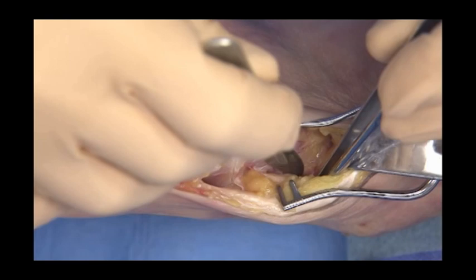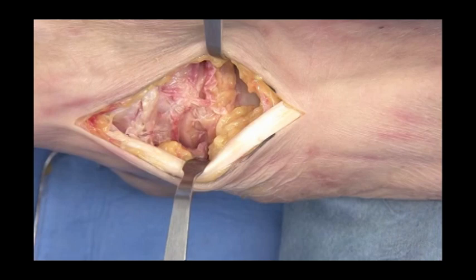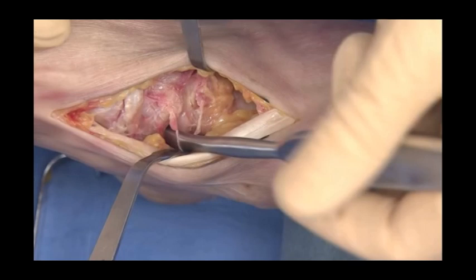After locating the medial ankle gutter, the joint is exposed by sharp dissection and retractors are positioned along each side of the joint. Joint release is performed and extended either medially or laterally depending on the foot deformity.